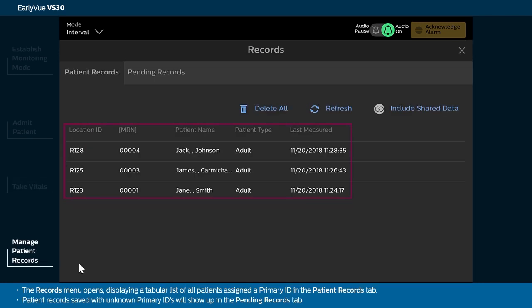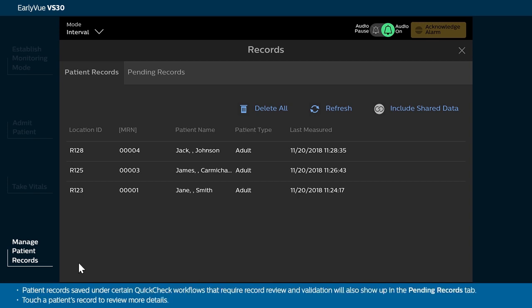The Records menu opens, displaying a tabular list of all patients assigned a primary ID in the Patient Records tab. Patient records saved with unknown primary IDs will show up in the Pending Records tab. Patient records saved under certain QuickCheck workflows that require record review and validation will also show up in the Pending Records tab.